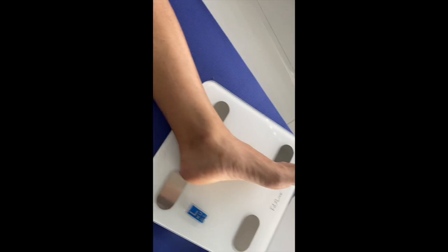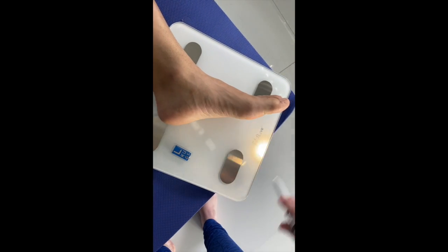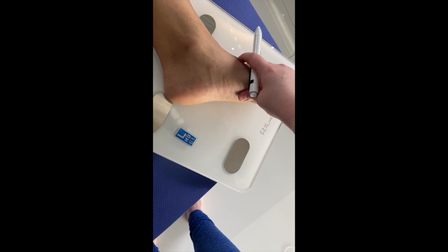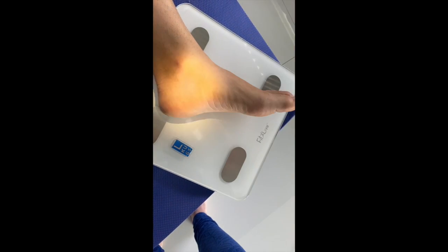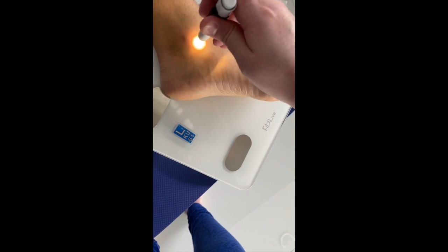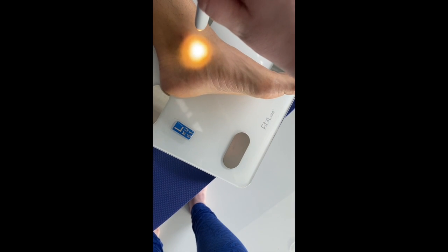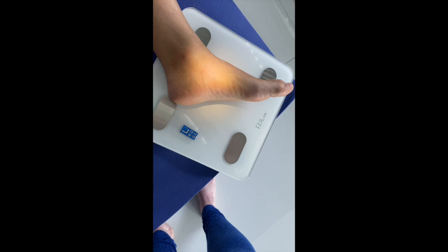For the lateral ankle, our patient is going to be recumbent with the affected side down. You want to make sure that their foot is dorsiflexed, that's only if the patient can tolerate it. We're going to be using a 10 by 12 cassette. You want to make sure that they're in a true lateral and that you can actually see the medial malleolus, because your CR is actually going to be perpendicular to the medial malleolus, right about here. Make sure it's at a 90 degree. Medial malleolus. You're going to be using a 40-inch SID and a 10 by 12 cassette.